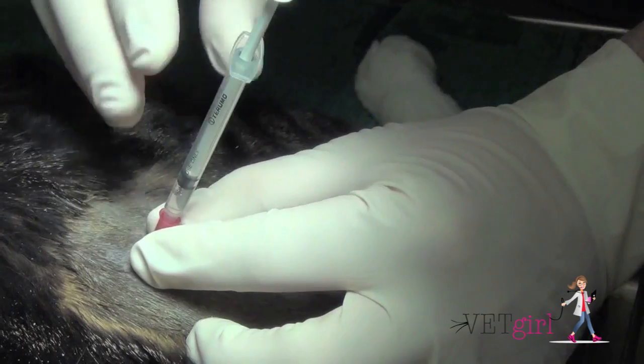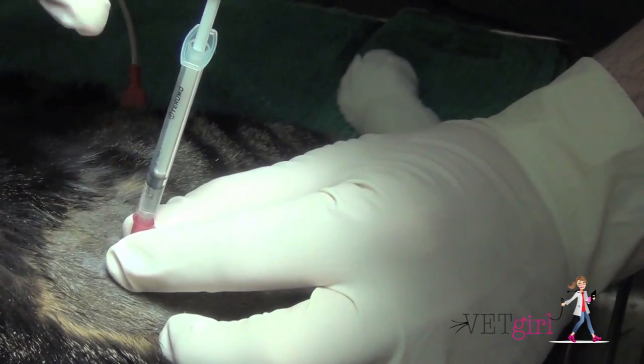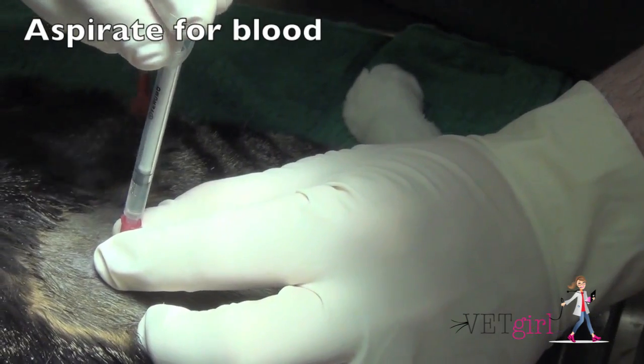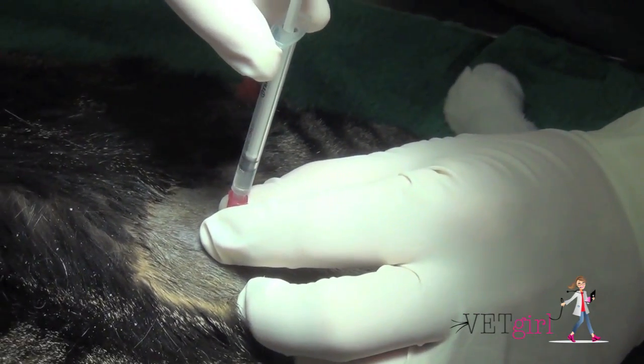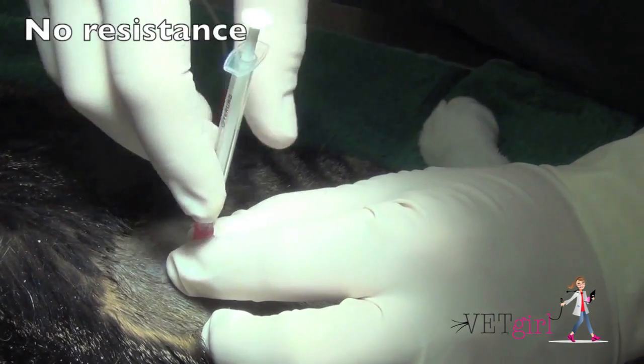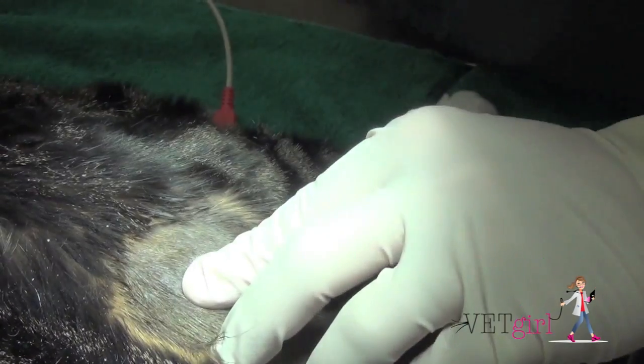The benefit of the coccygeal epidural is that it's going to block the pudendal and the pelvic nerves, basically providing analgesia to the penis, anus, colon, and perineal region. This is a very simple procedure to perform, and it provides analgesia for approximately one hour.